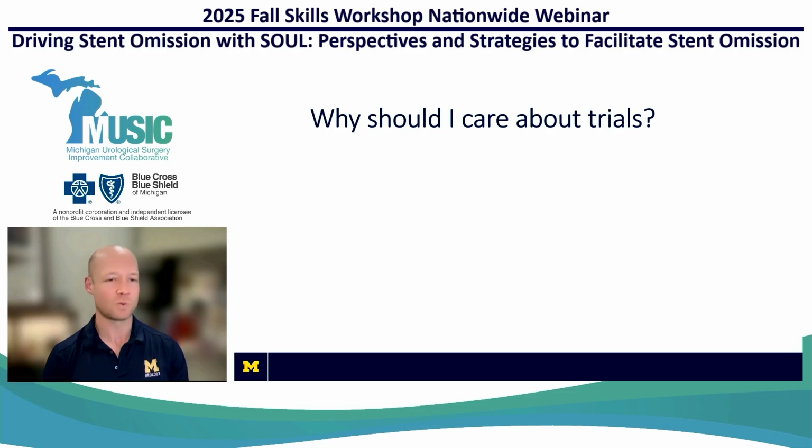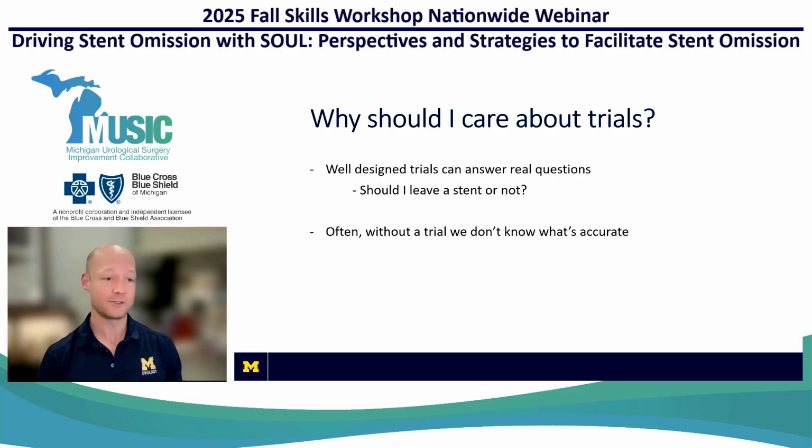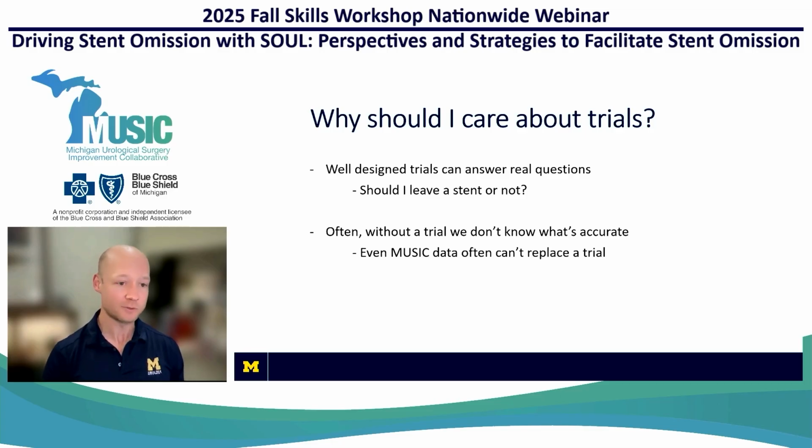So the big question here is why should we care about trials? Now, of course, we know that well-designed trials can answer very real questions. Specifically germane to today is should I leave a stent or not after uncomplicated ureteroscopy? And the big issue here is that often without a clinical trial, we don't really know what's accurate. So while we have great retrospective data, even the best retrospective data, including from MUSIC, often can't replace a clinical trial.